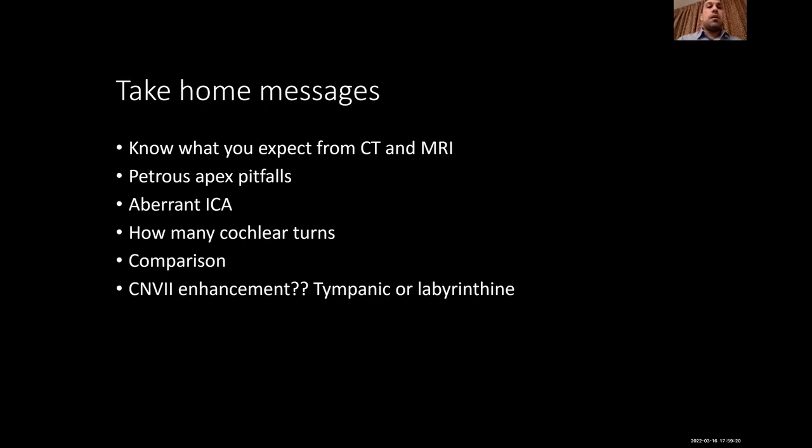Cranial nerve 7 enhancement: is it tympanic or labyrinthine? If labyrinthine, it is pathology. Tympanic, no. It could be normal, especially if there is no history.